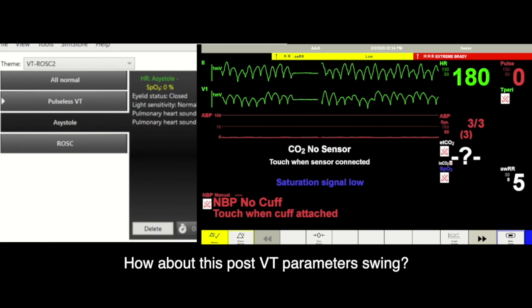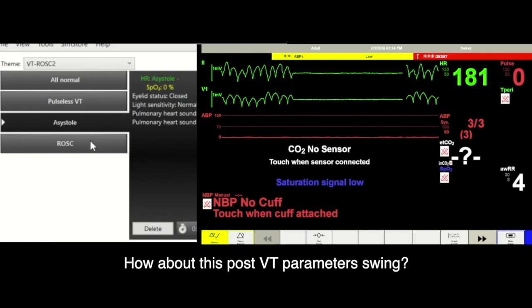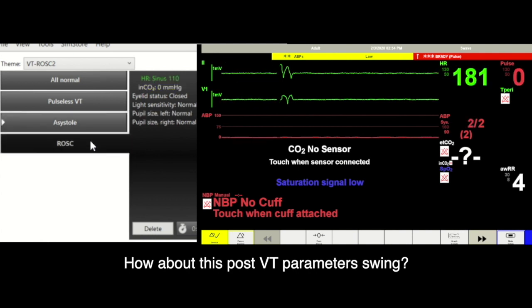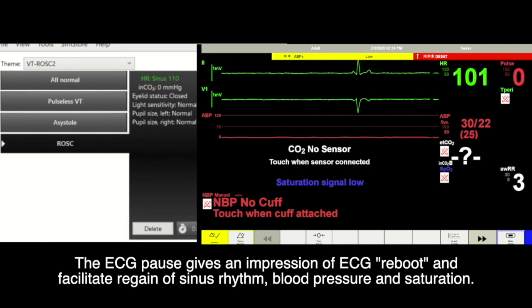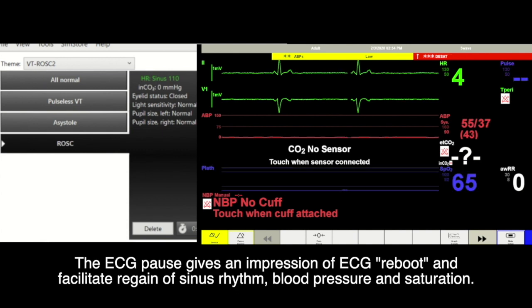Let us have a close look at the last portion of this video. A brief pause was inserted after the ventricular tachycardia, followed by progressive gain in heart rate, blood pressure, and saturation. The ventricular tachycardia conversion treatment produces a rhythm conversion parameter swing.